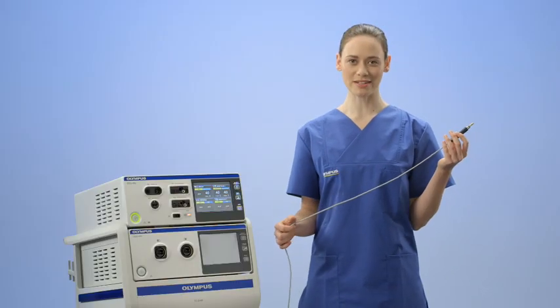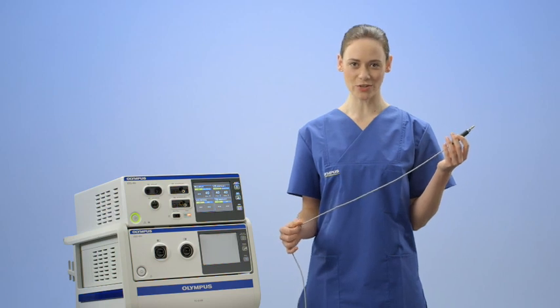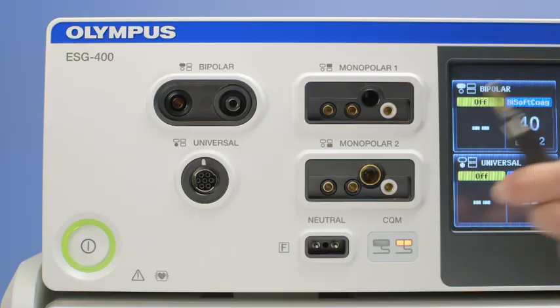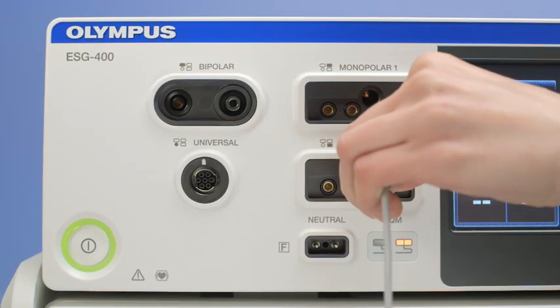The eight-millimetre plug gets connected to the central socket in the monopolar one connection area. The monopolar Erby type plug gets connected to the central socket in the monopolar two connection area.